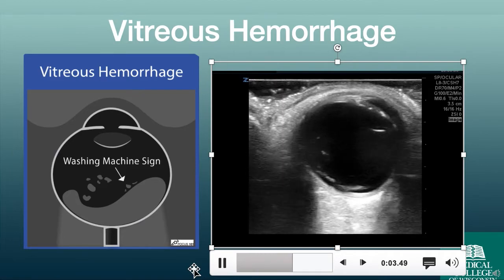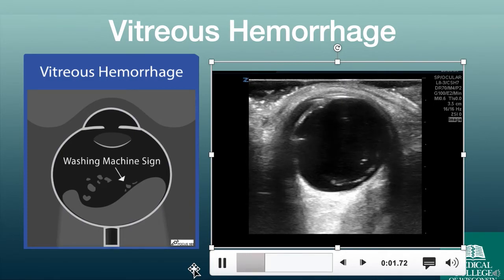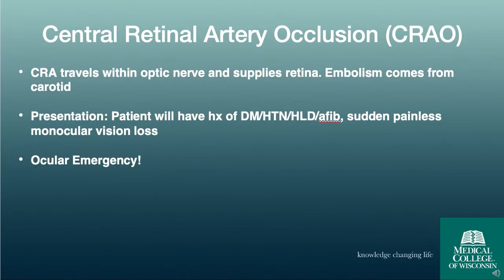And you may need to increase the gain and ask the patient to move their eye to really get a good view of that washing machine sign.